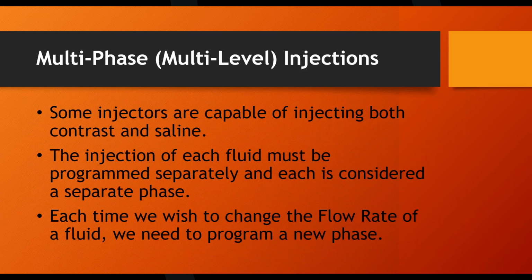If I select this one, for instance, you see there's a whole bunch more numbers on here. You see a green line, then a blue line, a green line, blue line, green line. There are six rows here. This is a multi-phase injection. This is a 6-phase injection. What that means is the very first line here, 10 and 200. Who the heck did this one? This is not realistic. Students must have done that one.